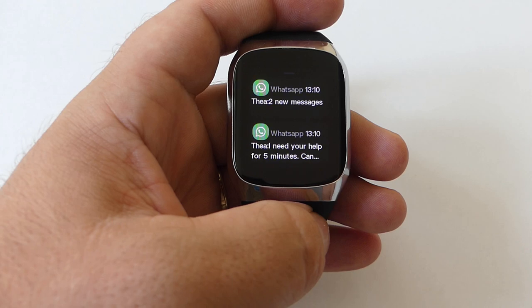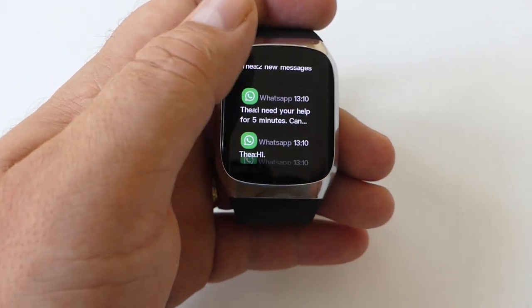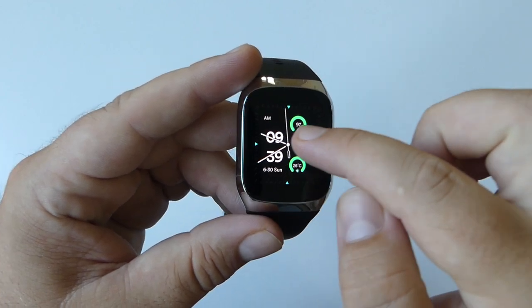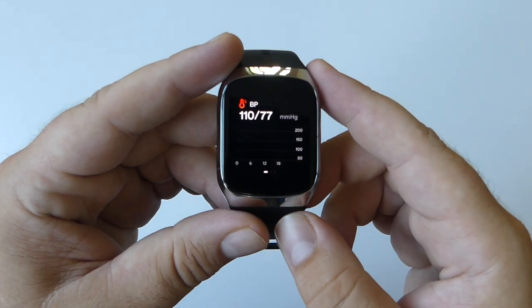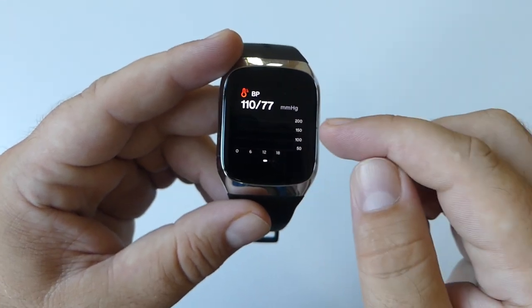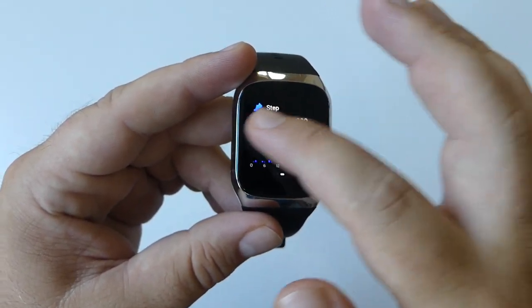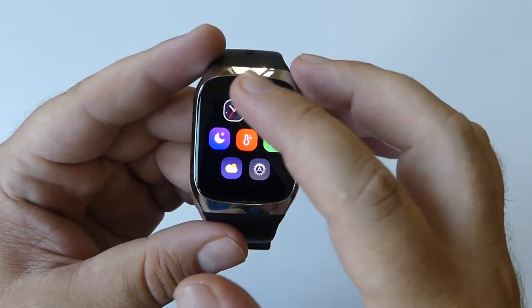If you swipe up, you'll have access to notifications. Here you can tap and read your notifications, and you also have the option to delete all of them. Swiping from the right side of the screen opens a shortcut menu including blood pressure, step count, and calories.